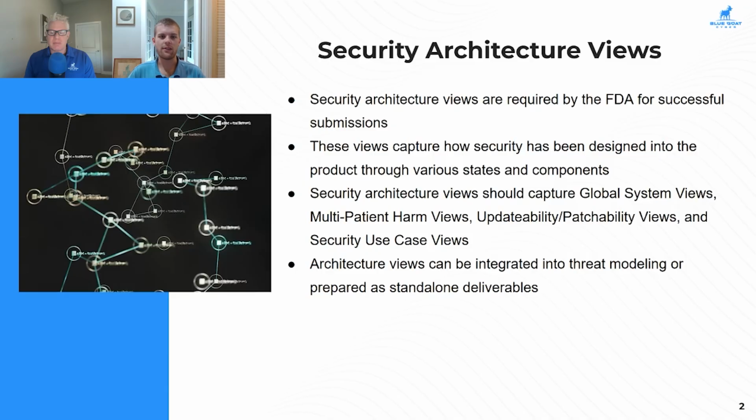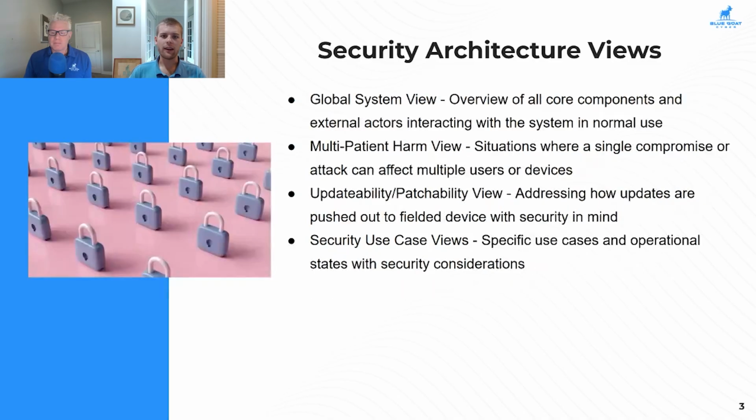Obviously, there are some differences in testing processes, labeling, documentation, things like that, are usually where we're going to see the most distinction. But this is a fairly standardized approach, how we're addressing these architecture views. All right, I'll get a little bit more into what each of these views are.